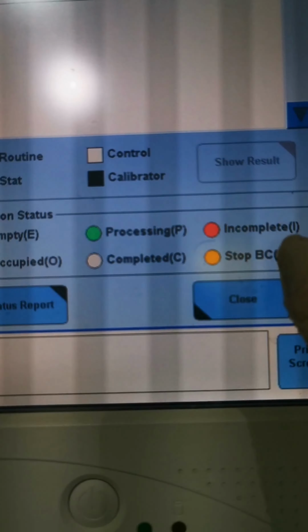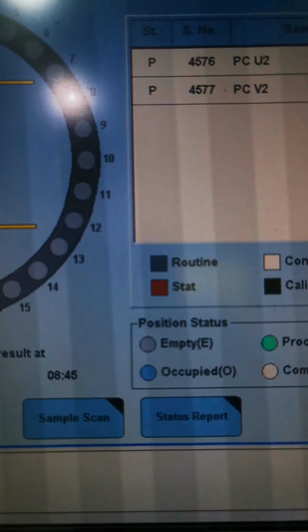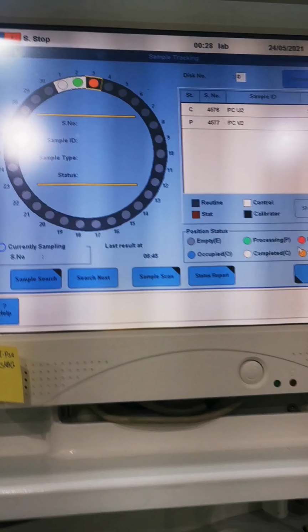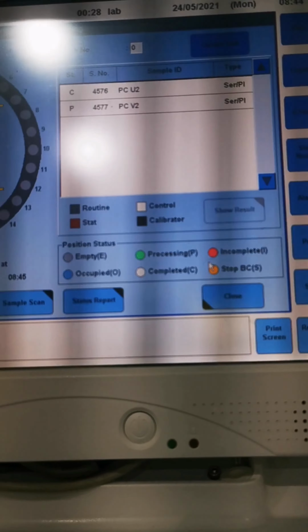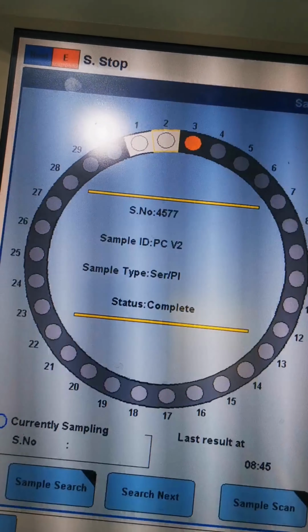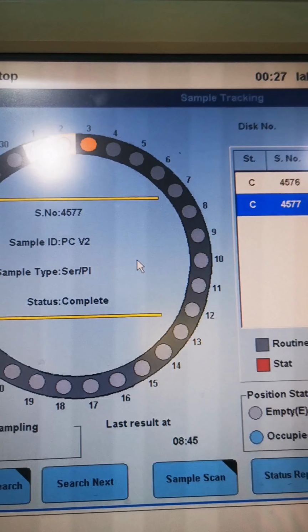Our number 3 position is for our stop, and it is represented by the orange color. And now the number 1 is completed, which is our PCU2. Then after some time the PCV2 is also completed.